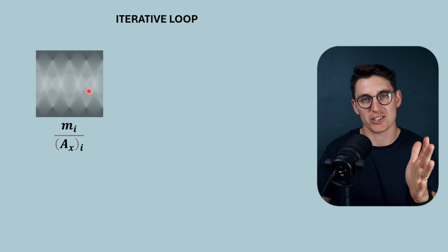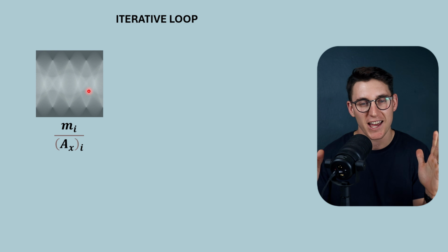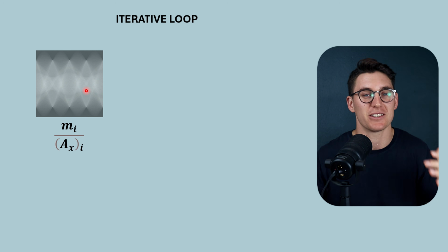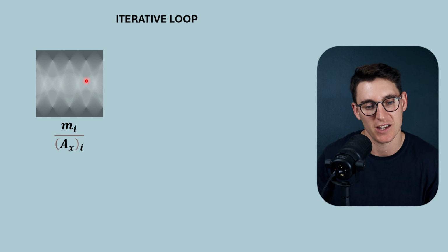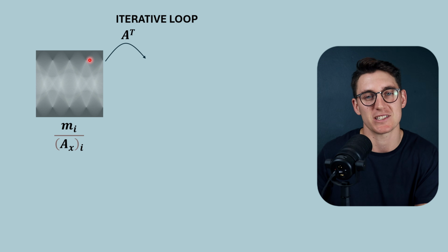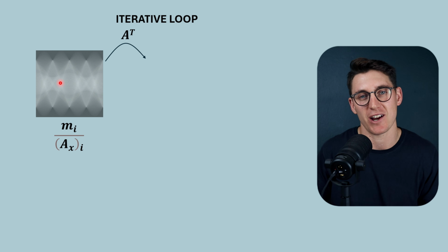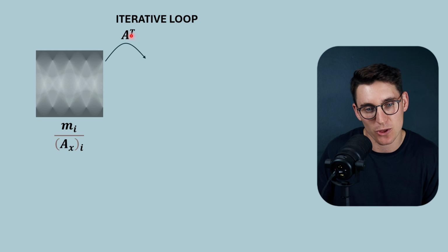What we want to do is take this new data and essentially create a spatial image again, in x and y coordinates, as to where the differences are between these two images. So we could back project effectively and create a back projected image of these differences here. Now, instead of back projecting, what we can do is what's known as a transpose of this image. We're essentially mathematically back projecting this sinogram, but accounting for those system geometries. We are transposing through that initial matrix that we have applied to our initial estimated image.